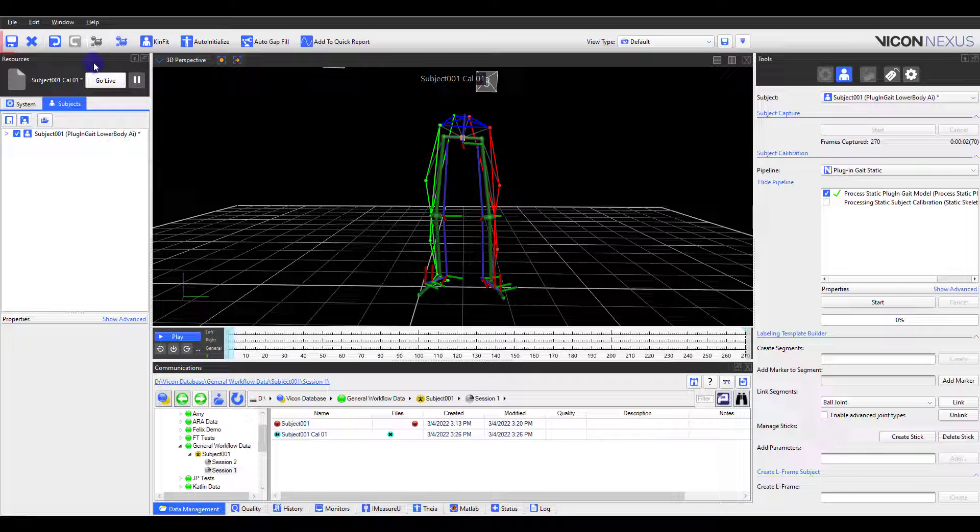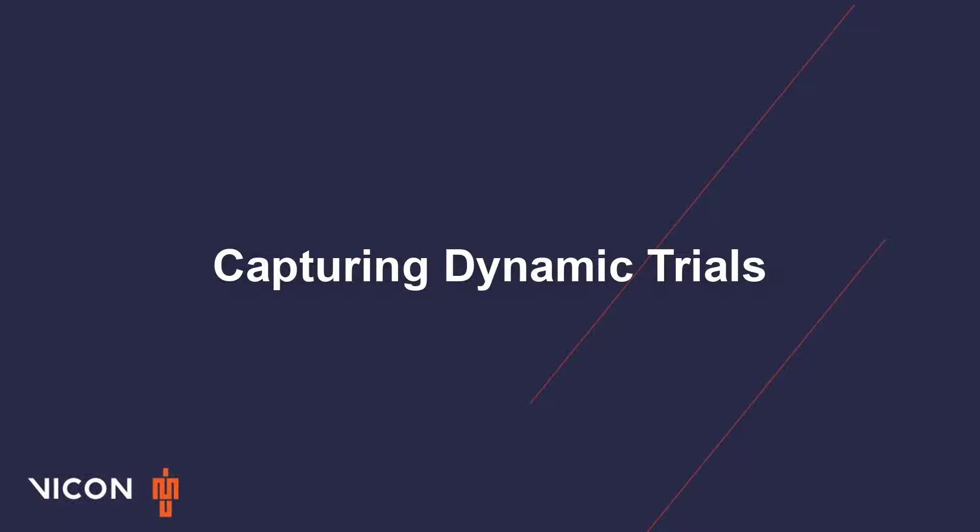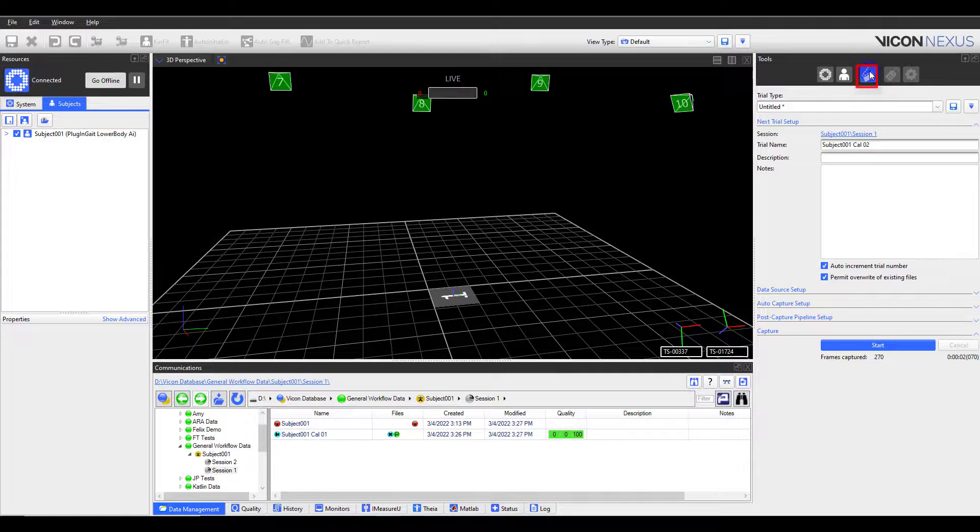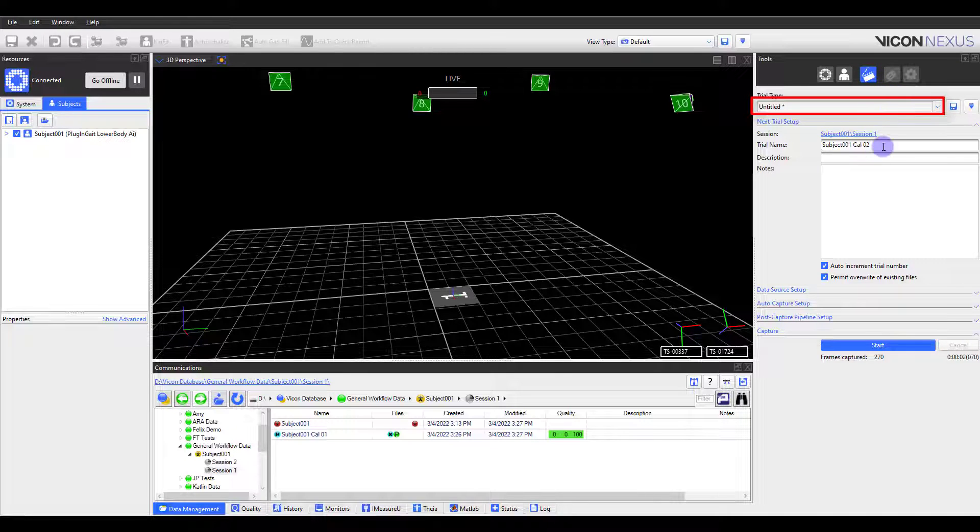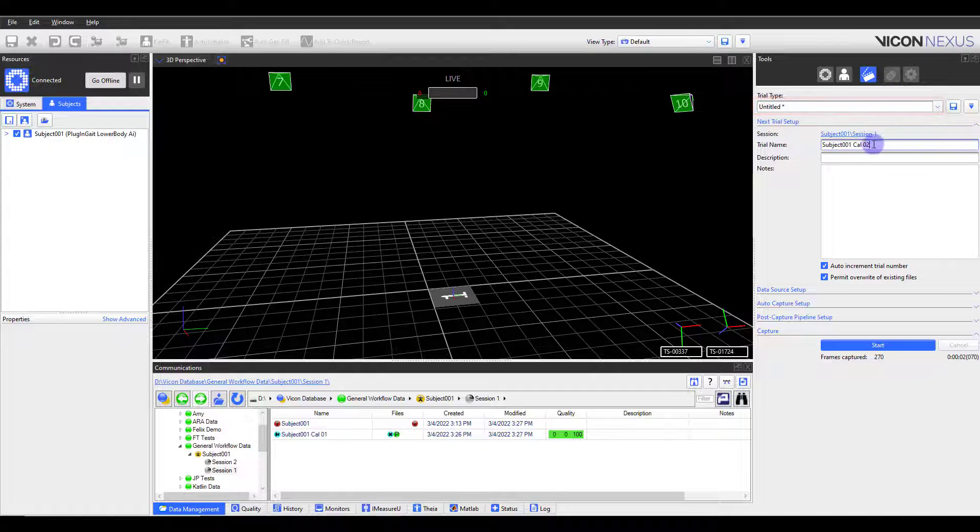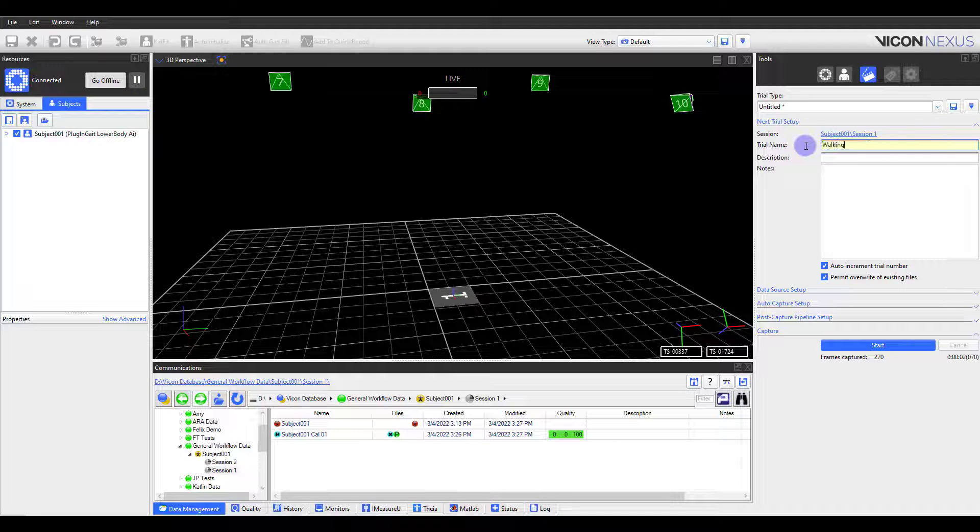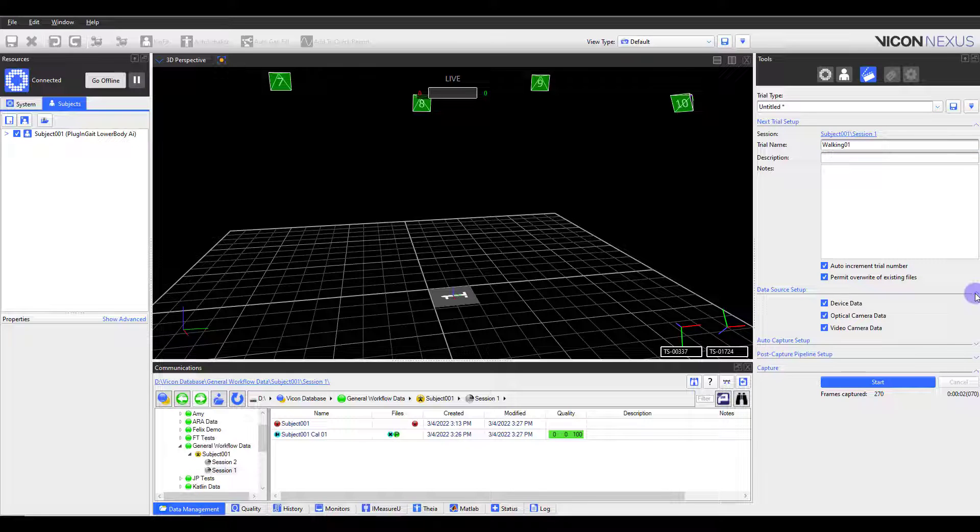Now that my static trial has been processed, I will save it and go live to collect my dynamic trials. I'll navigate to the Capture tab. If applicable, select the correct trial type from the dropdown, give the trial a name, and add any description or notes. It's also a good idea to double check the desired data sources are checked.